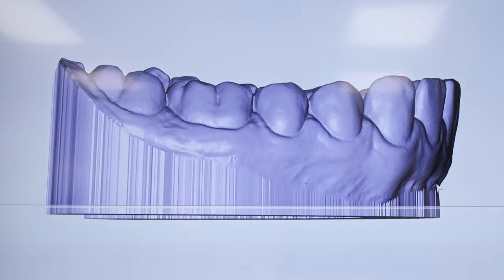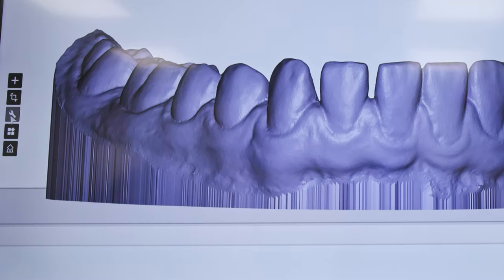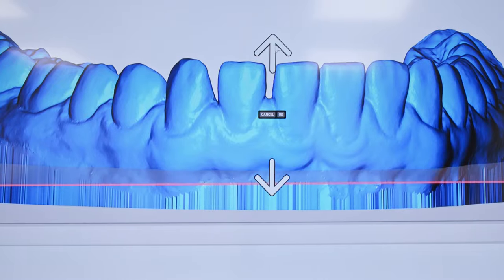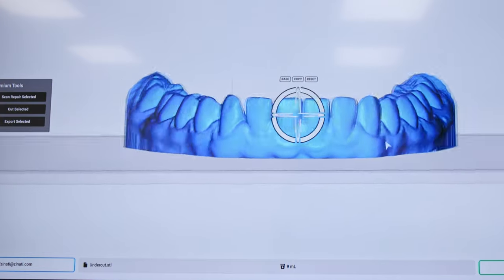If the model is left at this height when you make the thermoplastic material, the plastic will get caught underneath this area. When you want to remove it, it's going to be very hard — either you'll crack the retainer or aligner, or cause distortion in the plastic. So we're going to do another plain cut and move the cutting plane right where the undercut area ends. Now we're ready for print.